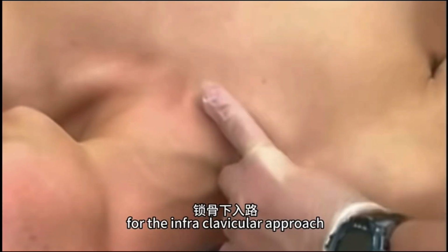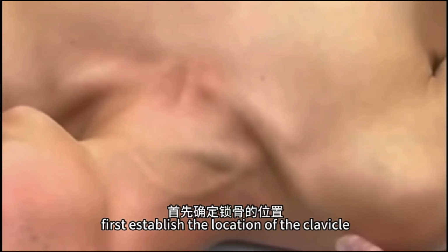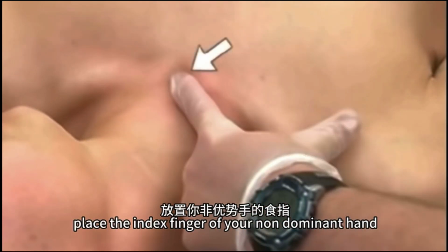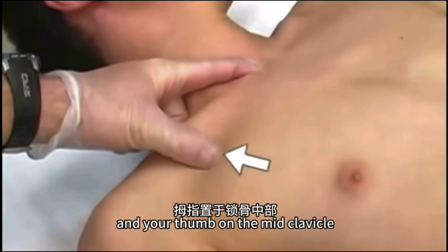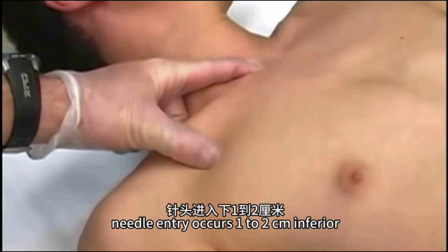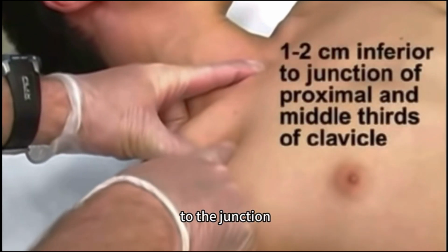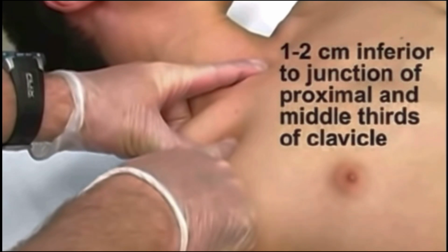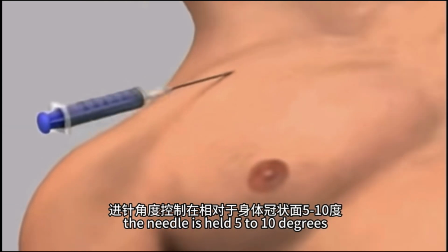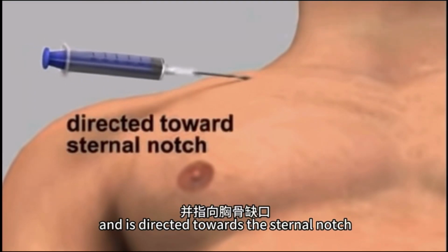For the infraclavicular approach, which is the most commonly used, first establish the location of the clavicle. Place the index finger of your non-dominant hand in the sternal notch and your thumb on the mid-clavicle. Needle entry occurs 1 to 2 centimeters inferior to the junction of the proximal and middle thirds of the clavicle. The needle is held 5 to 10 degrees to the coronal plane of the body and is directed towards the sternal notch.